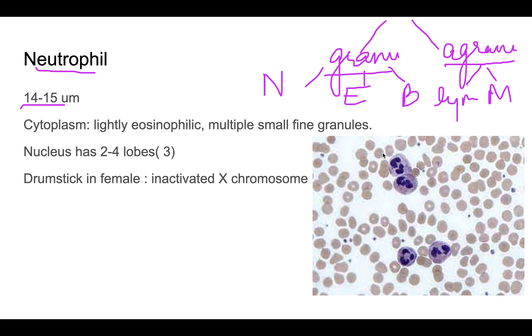The neutrophil has an average size of around 14 to 15 microns. When discussing WBCs, we look at both the cytoplasm and the nucleus. The cytoplasm of a neutrophil is slightly eosinophilic and has multiple small fine granules — the key point being that the granules are very fine, multiple, and very small.